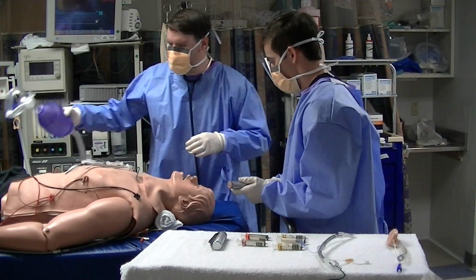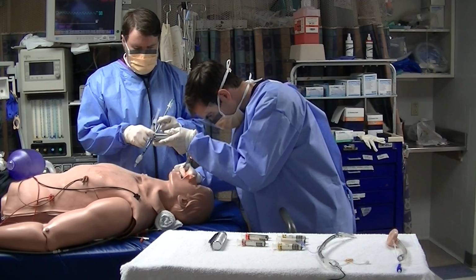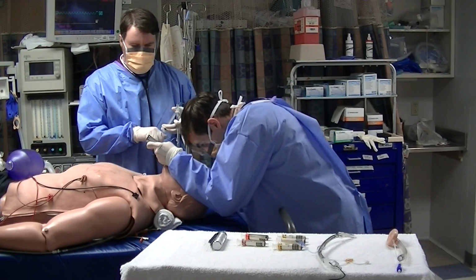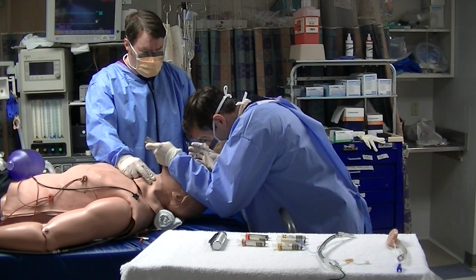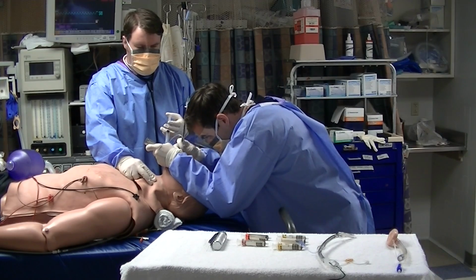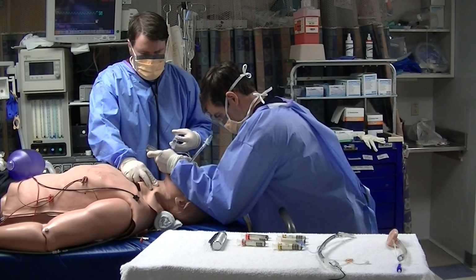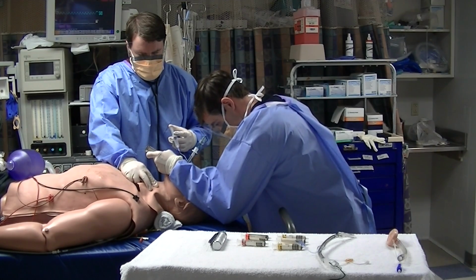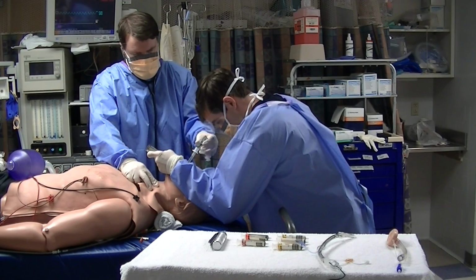Once the provider has adequately pre-oxygenated the patient, he uses his right hand to pry open the mouth and insert the laryngoscope smoothly using his left hand without hitting the patient's teeth. He then visualizes the vocal cords, keeping his eyes on the vocal cords, grabs the ET tube and smoothly inserts it into the vocal cords. For most adult patients, the ET tube should be placed at a depth of 21 to 24 centimeters, which are marked on the ET tube itself.